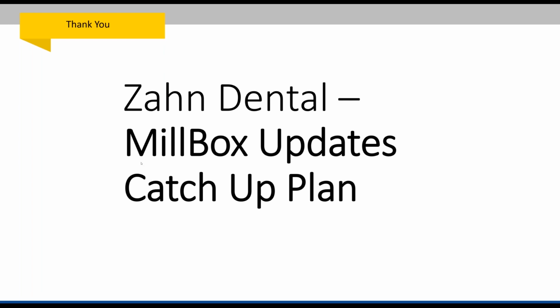They're doing a catch-up plan for your Millbox updates, and you can get more information from Zahn directly. But in short, they're doing something that I've never heard of to date, and I really don't think it's going to be around too long, because it's such a good deal. No matter how far out you are, no matter how far behind you are, and even if you're way back on some 3D software, basically for the cost of 1 year of annual updates, they're going to bring you all the way current. They're going to bring you to 2021.